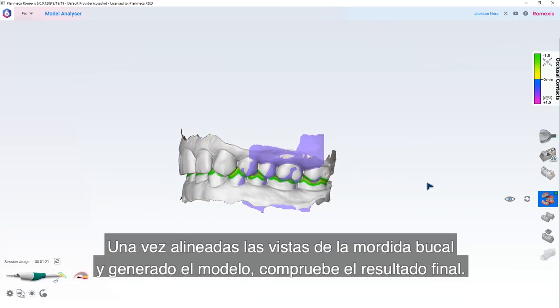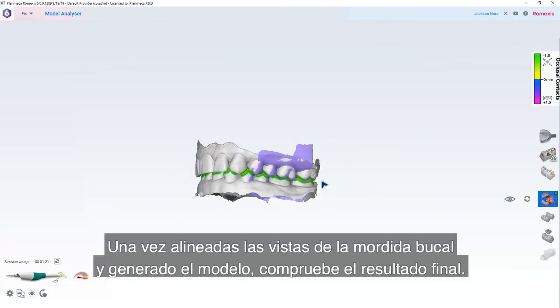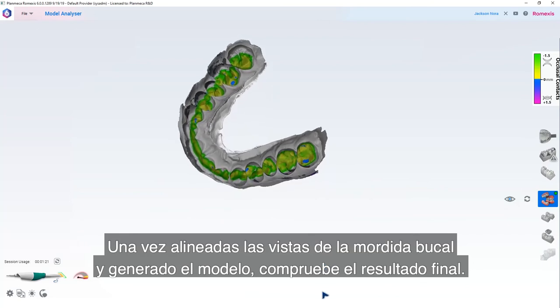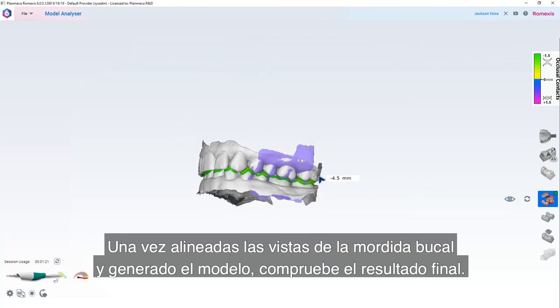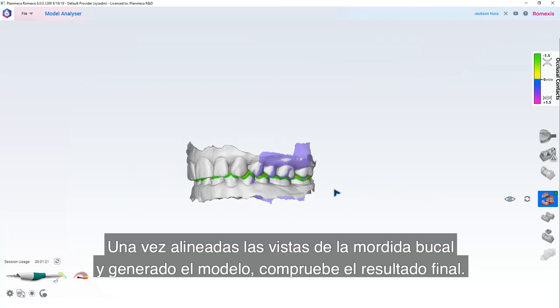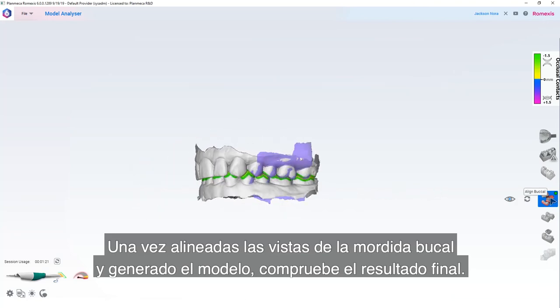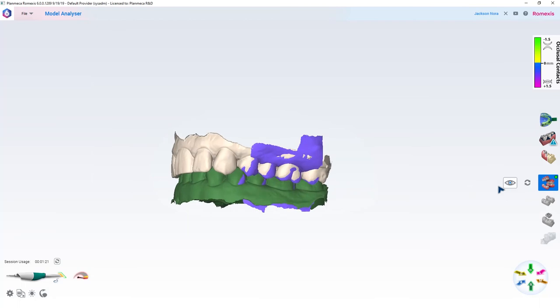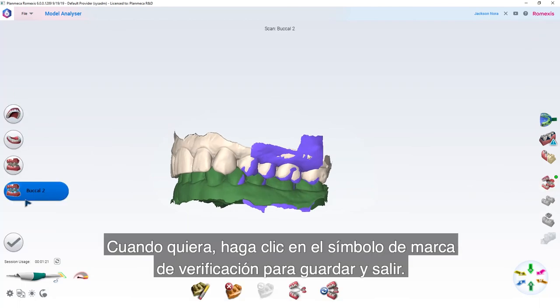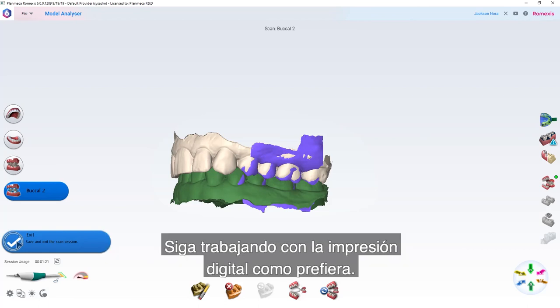Once the buccal bite views have been aligned and the model generated, check the final result. Once you are ready, click on the checkmark symbol to save and exit. Continue to work with the digital impression as you prefer.